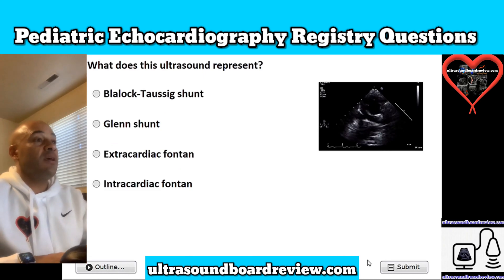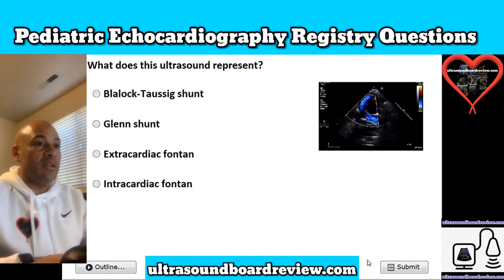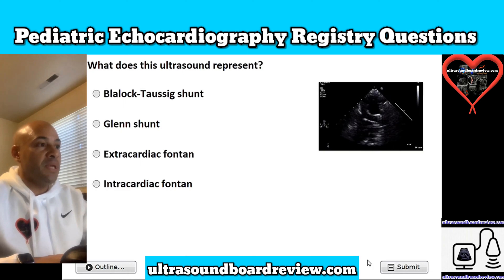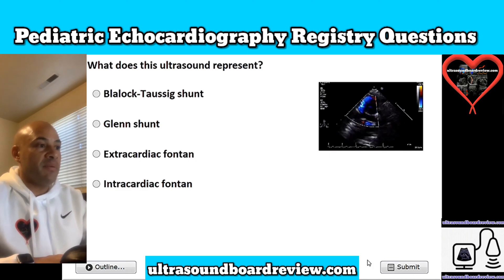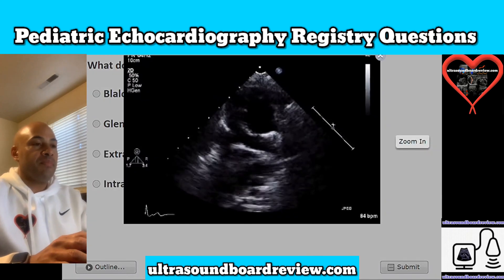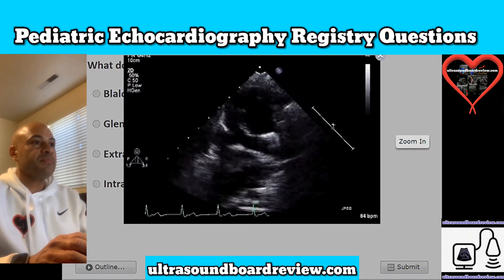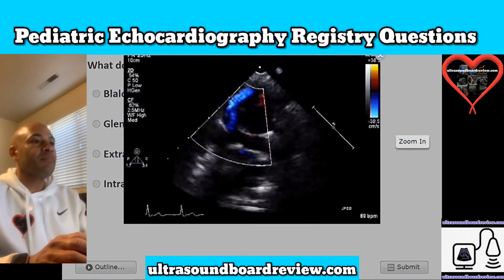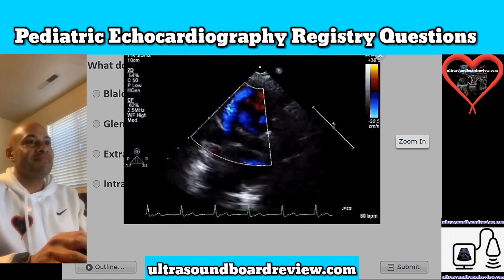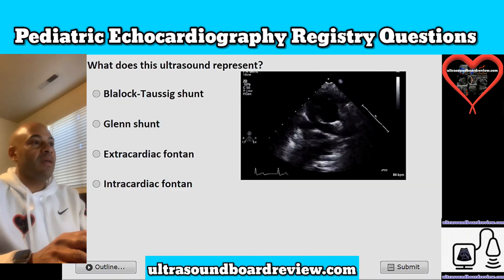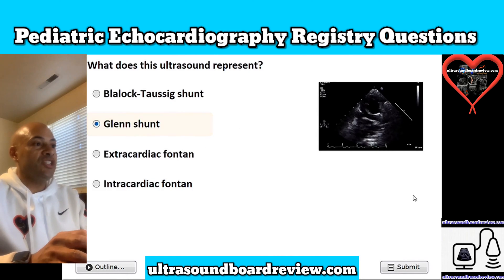Question 8. What does this ultrasound represent? Is it A, a Blalock-Taussig shunt; B, Glenn shunt; C, extracardiac Fontan; or is it D, intracardiac Fontan? The answer is B, Glenn shunt.